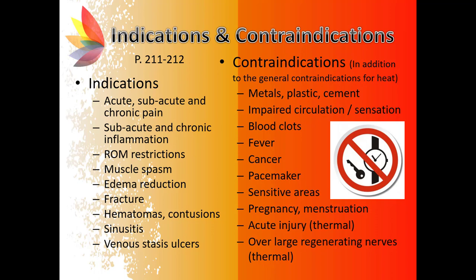The indications and contraindications for the use of shortwave diathermy. The indications include acute, subacute, and chronic pain, subacute and chronic inflammation, range of motion restrictions, muscle spasm, edema reduction, fracture healing, hematoma and contusion resolution, sinusitis, and venous stasis ulcers.